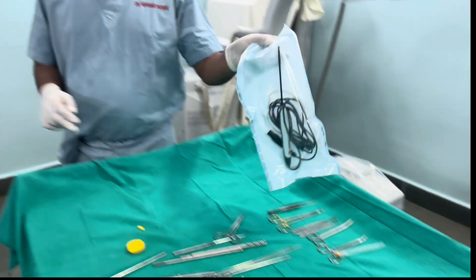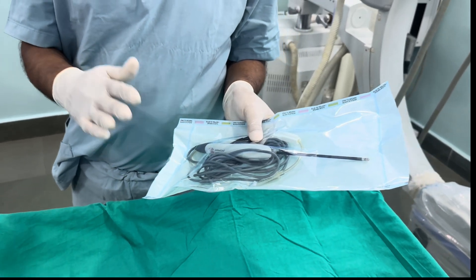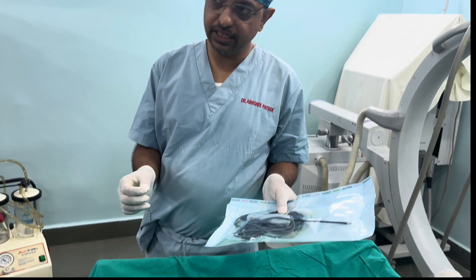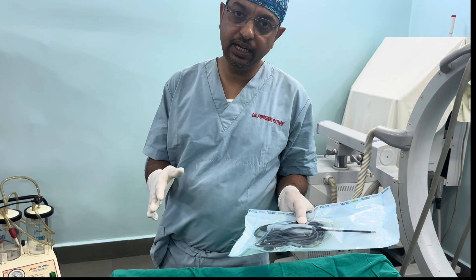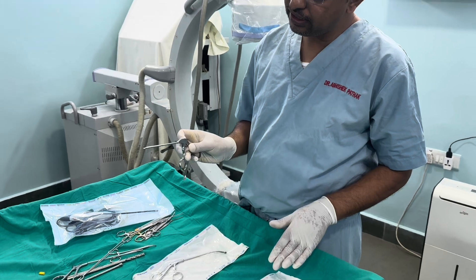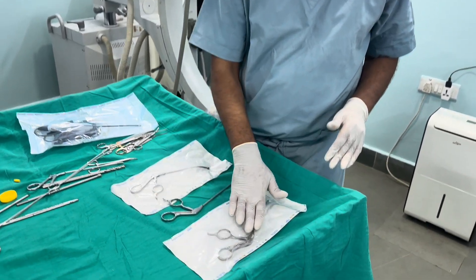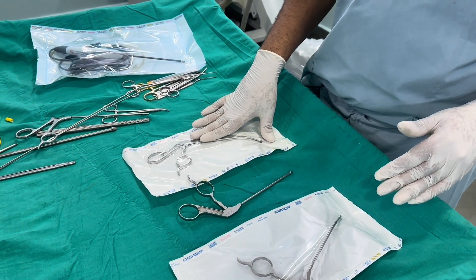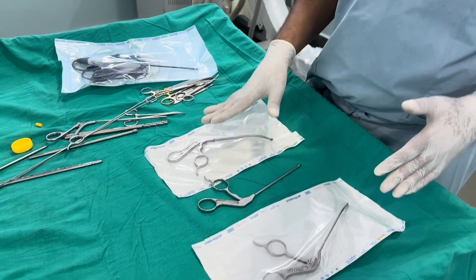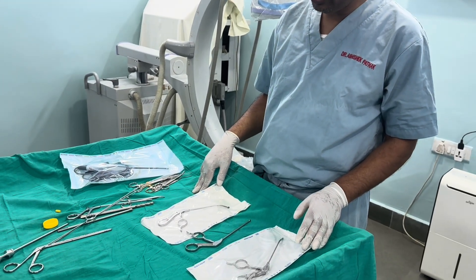The RF ablator console is connected with the probe for coagulation as well as ablation — it is a plasma generator that generates very high temperature around the probe to ablate tissue. The most commonly used punch is the straight 4.5mm punch. We also have right and left punches used for the right and left corners, especially for posterior horn meniscal tears.